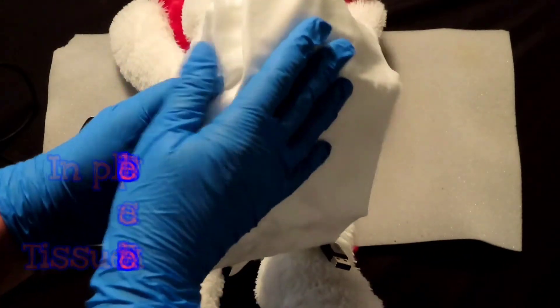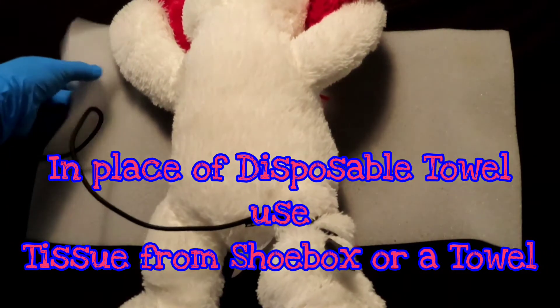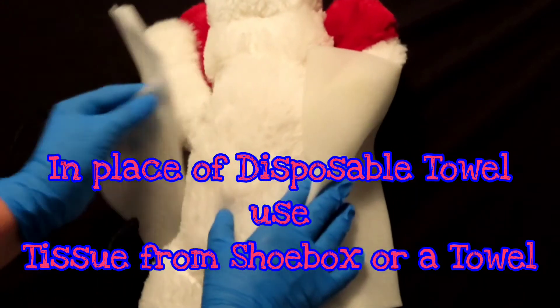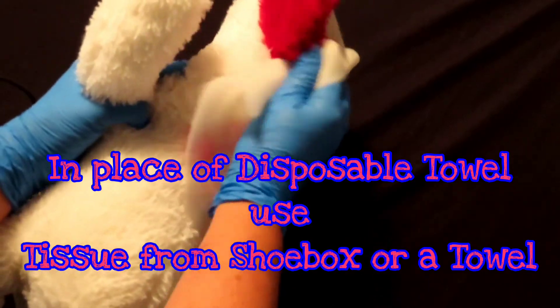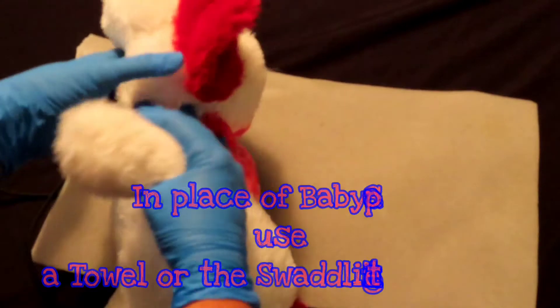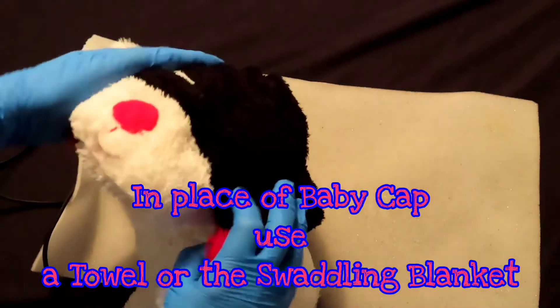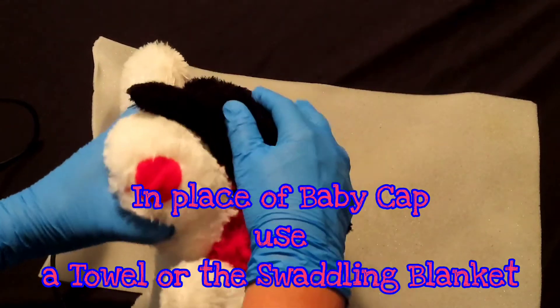The OB kit comes with a disposable towel. In lieu of the towel, my shoe box came with a spongy type material, so I will use this to clean the baby. Make sure you get the head too. You're about to cap it. I don't have a cap, so get creative — maybe you could repurpose your gloves, or a sock, whatever. Just remember, 80% of the heat comes out of the head, so let's cover that head.